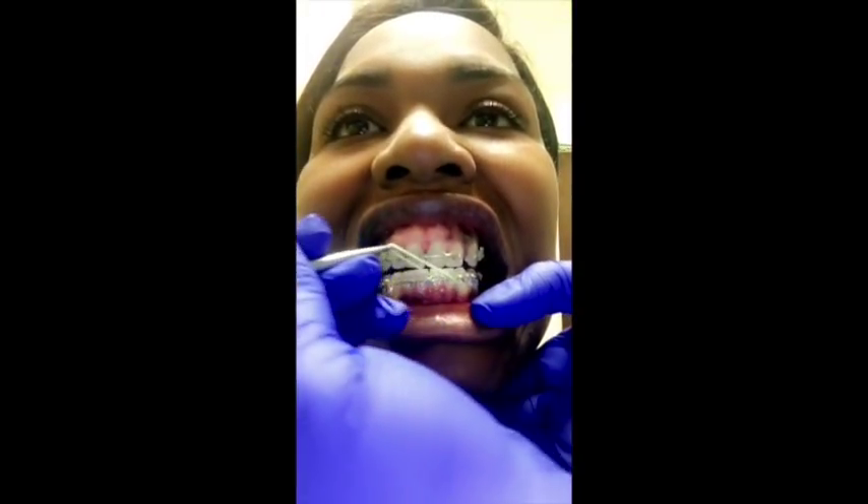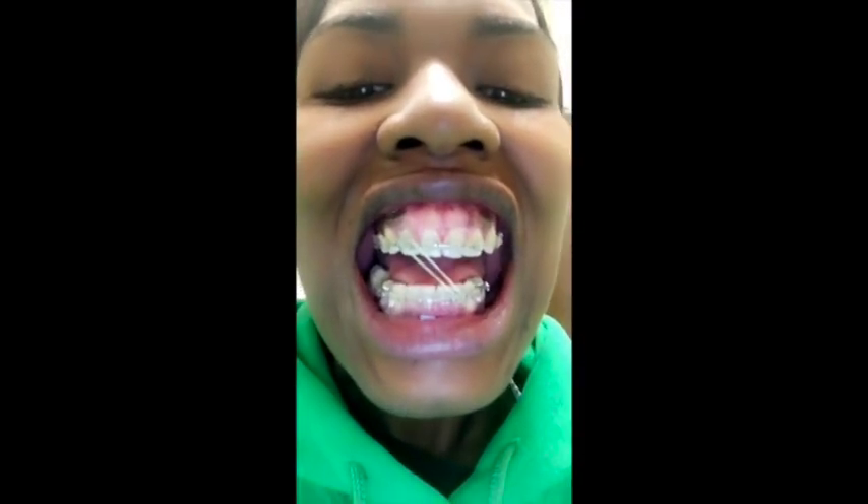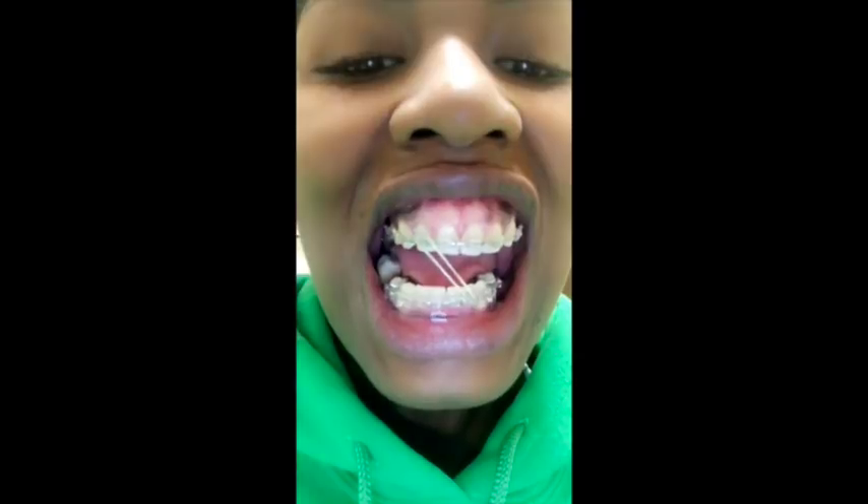Now she's going to teach me how to put this band across my mouth — from this hook right here up to this hook right here, and that's it. Whenever you're ready to eat or brush, you just pop that band off, throw it away, and once you're done brushing or eating, go ahead and put a new one on. Keep it on all day long like this.